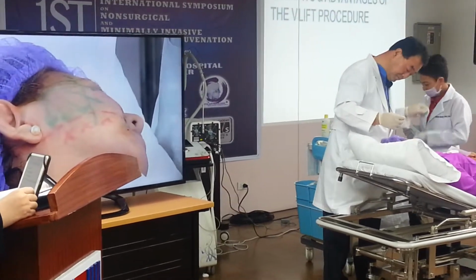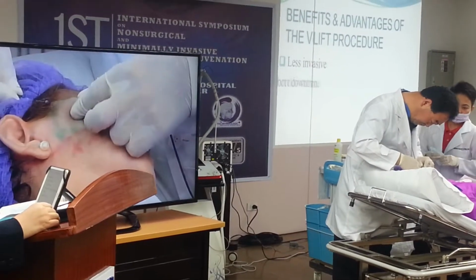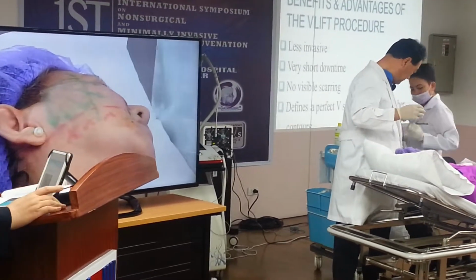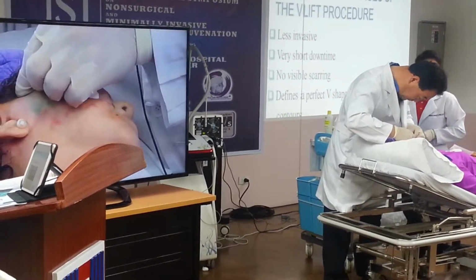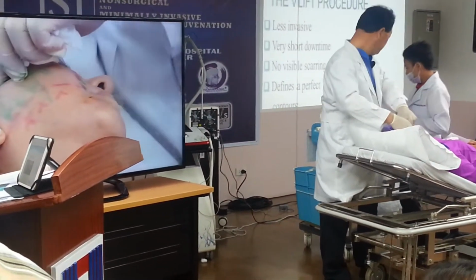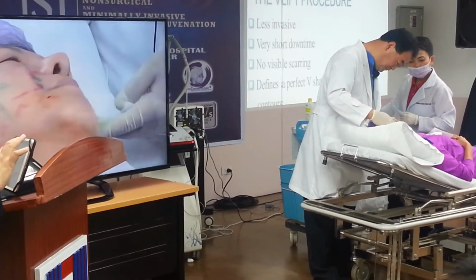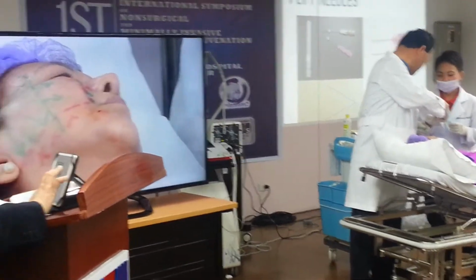Next slide, please. For the benefits and advantages of the V-lift procedure, it's less invasive, very short downtime, no visible scarring. It defines a perfect V shape with smoother contours, and it brightens the skin. Just for the info of the audience, I normally would do the PDO when a patient is 40 years old and below. This is an unusual case because the patient is 59 years old. But at the same time, she's a good case for PDO, for the cog lift because she really has sagging jaws already. Next slide. We now go to the V-lift needles, which are just flashed here for your information.